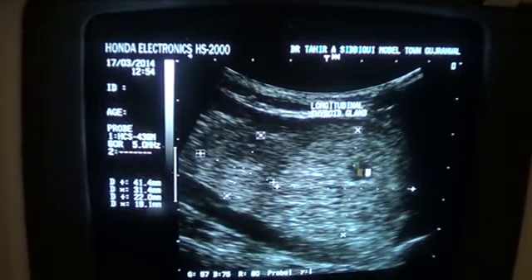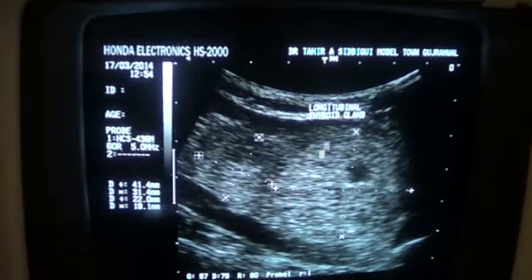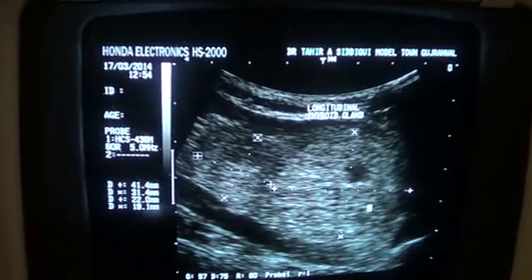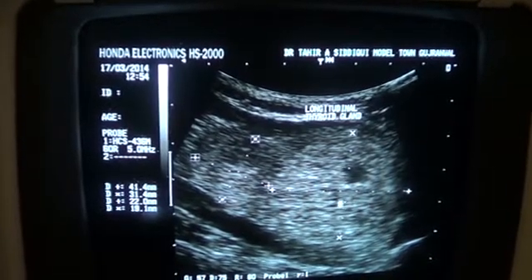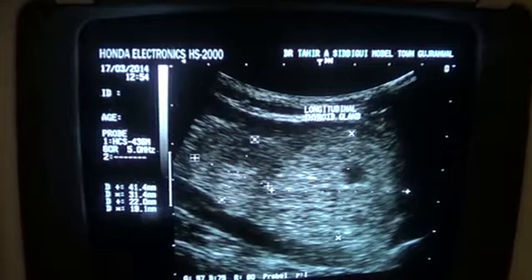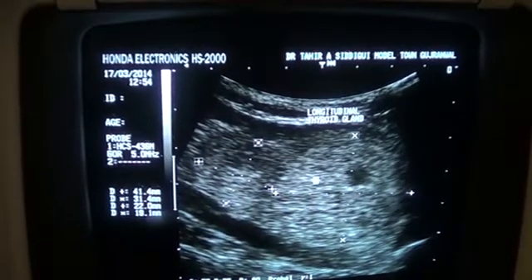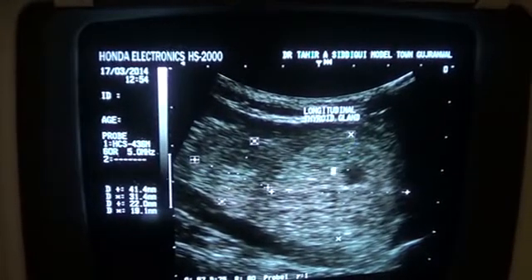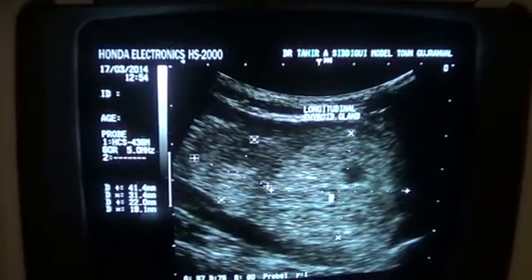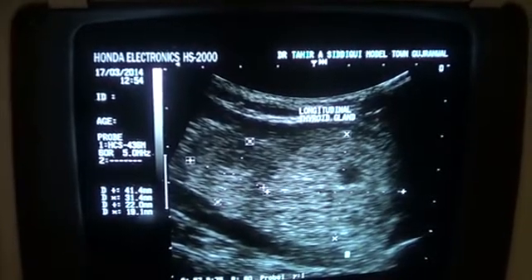With a cystic area within it, this is an echogenic mass, well demarcated. You can see the outer surface, with no posterior wall acoustic enhancement. These tiny cystic structures are representative of blood vessels, maybe. Because I do not have the facility of a Doppler, I cannot inform you about the vascularity of this mass. It is well demarcated, though, and no internal calcifications are seen in this.